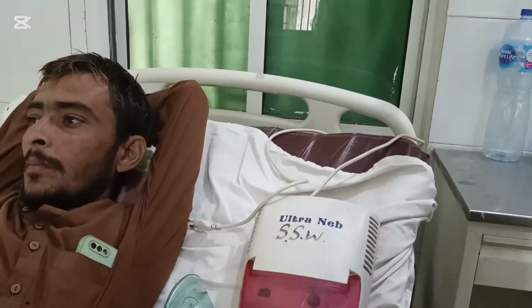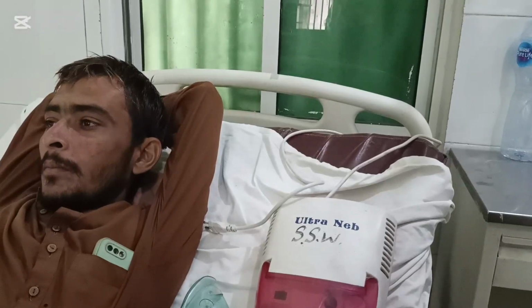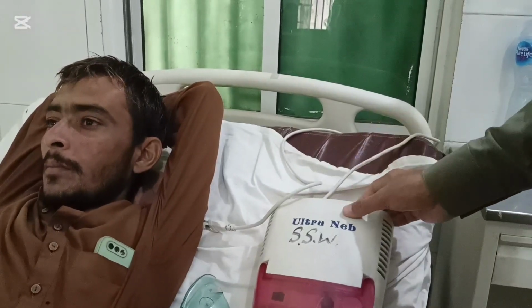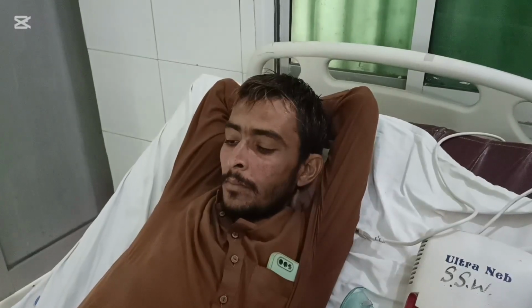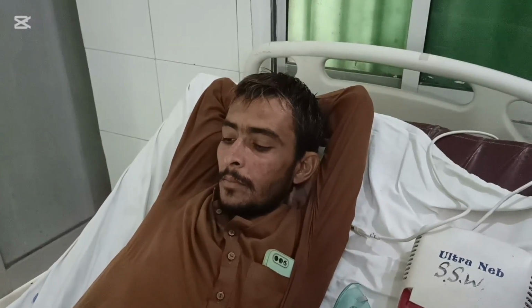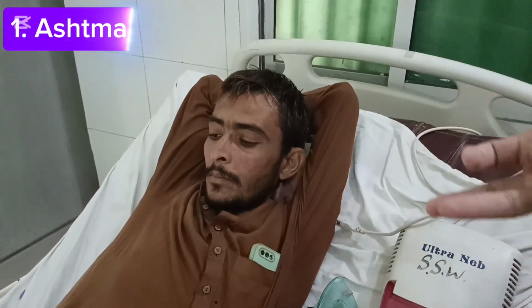In this video, I am going to talk about how to nebulize a patient. But before nebulizing the patient, there are some indications and contraindications of nebulization. The first indication is asthma. When the patient has asthma, the patient should be nebulized.